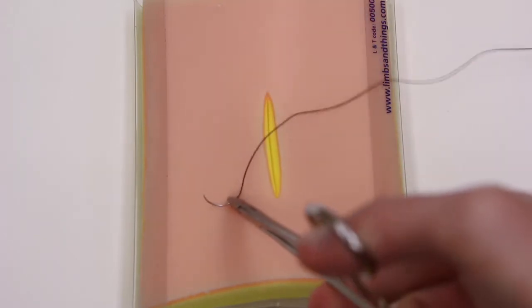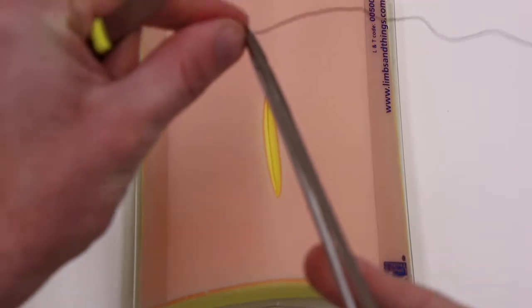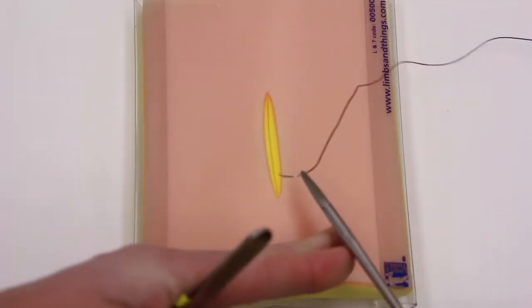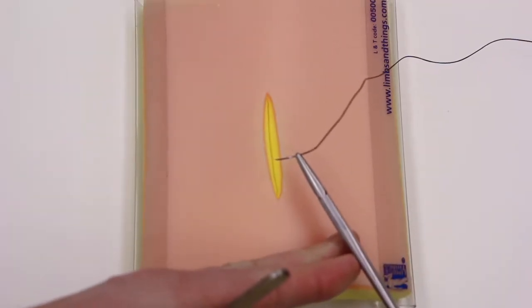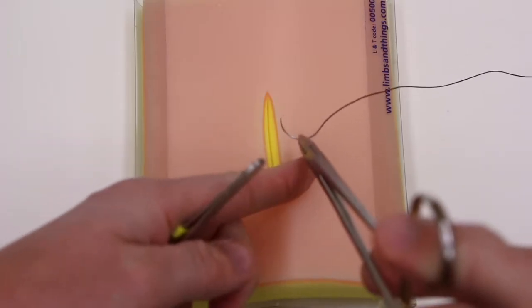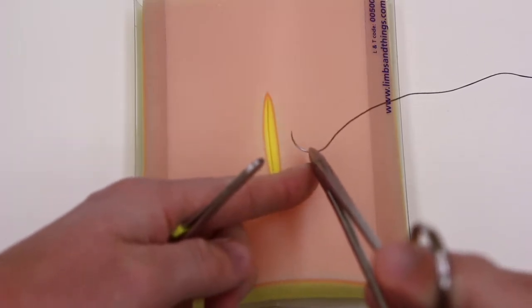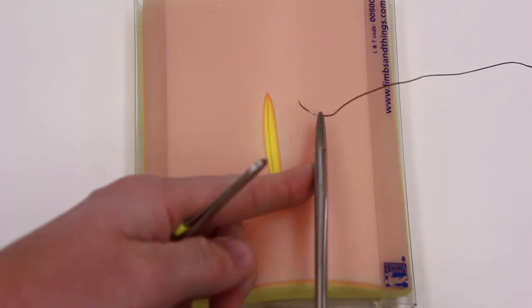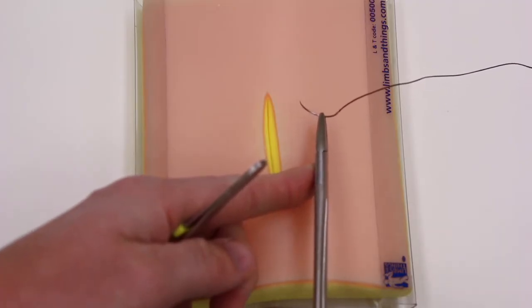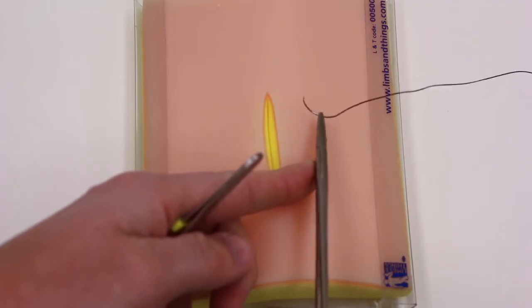First thing to work on is just loading the needle correctly. So you want to load the needle just on the tip of the needle driver, approximately one-half to two-thirds the way from the pointy end. That just gives you a balance of control of the needle and range.